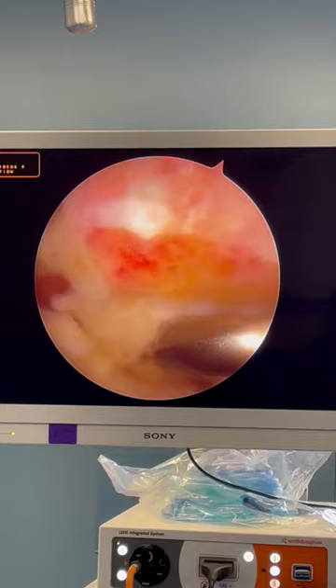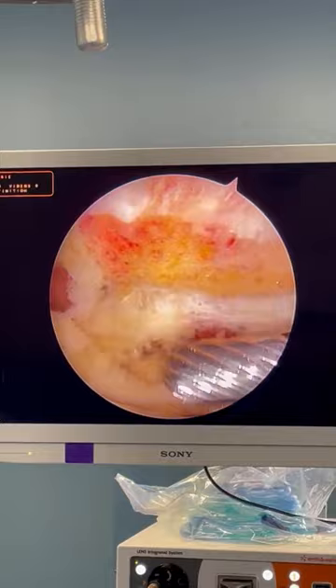Here the bone spur has been removed and the patient has extra space to prevent injury to the tendon below.